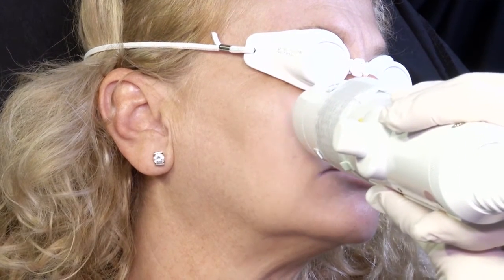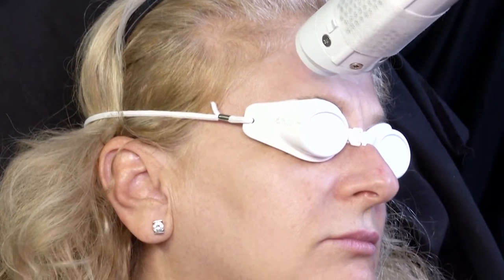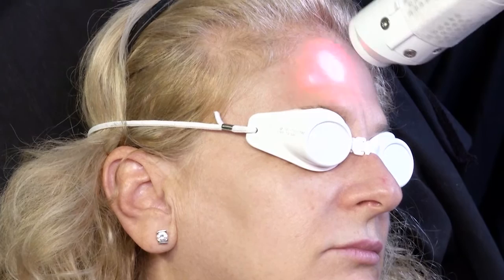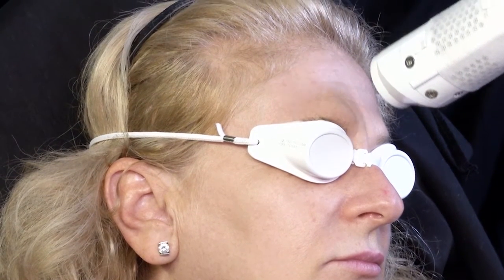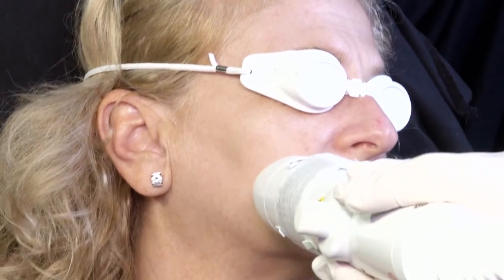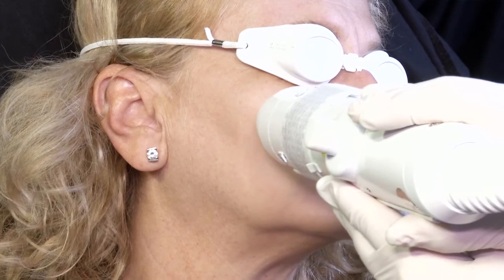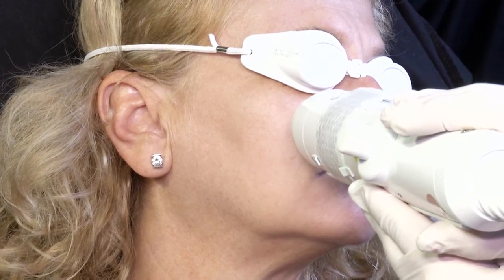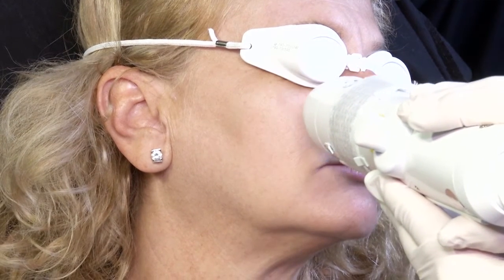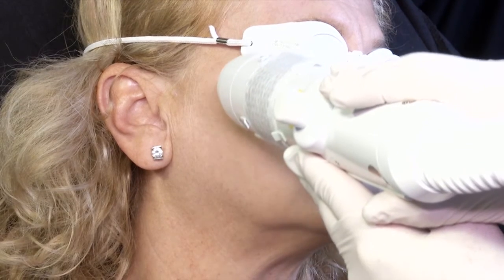It doesn't get much easier than this. I'll combine this with peels, with botulinum toxin neuromodulators, with fillers — there are really a lot of other things we can do with this. You're going to see us do Thermitite later; I've done this on someone's face, done Thermitite on their skin and neck at the same time. You're going to see us do Eclipse PRP — I've combined this with PRP on the same day. You can really do all these things together.